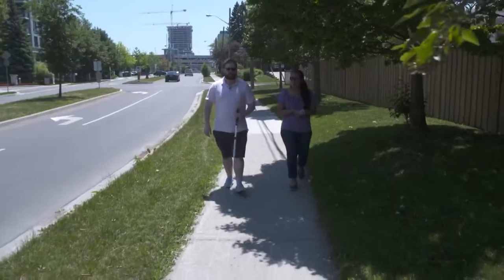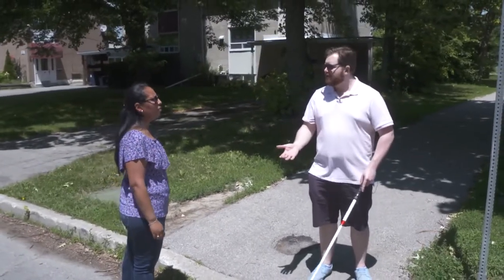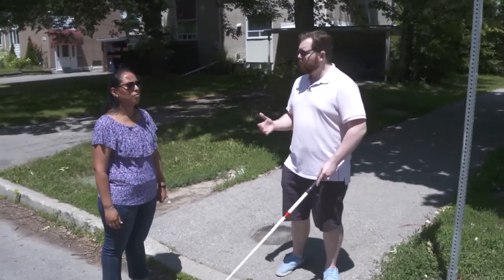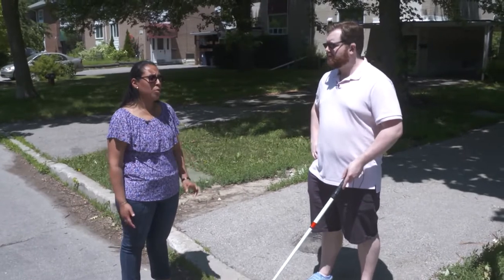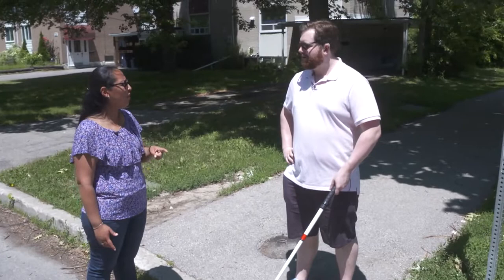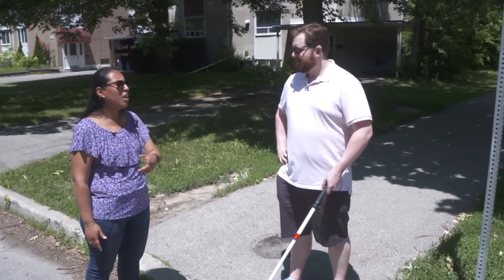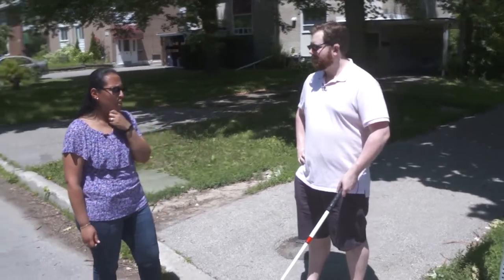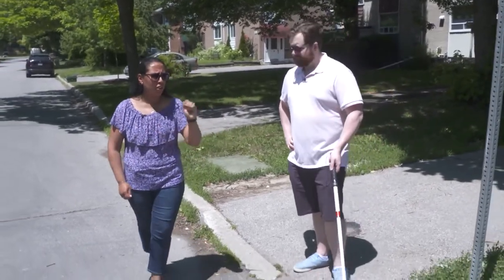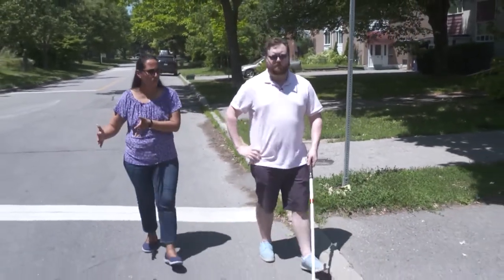Alex Smythe: Learning on paved pathways is great, but what about when the path ends? Anita Laurinaitis: We're at a curb — there's a road in front of us but no sidewalk on either side. In this situation, we're going to do what we call country travel: face the oncoming traffic and keep closest to the curb. You're going to shoreline the curb — touch the curb, touch the road — keeping that curb in contact at all times so you don't stray into the middle of the road.